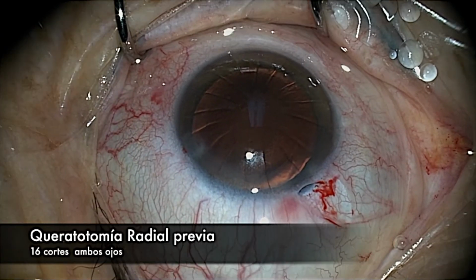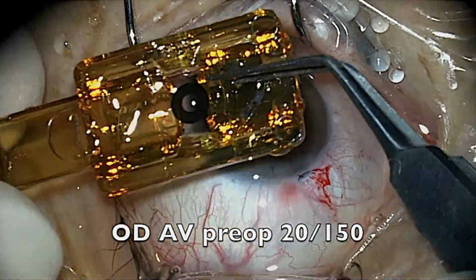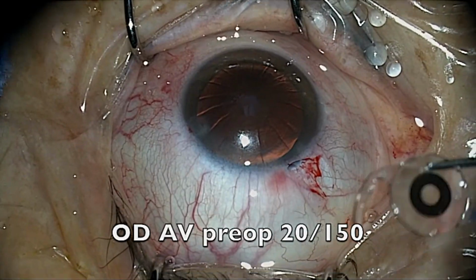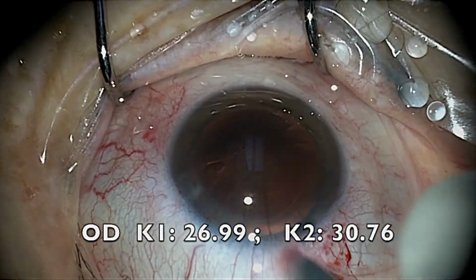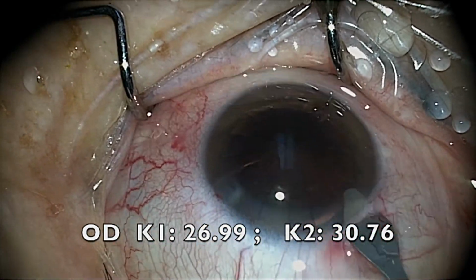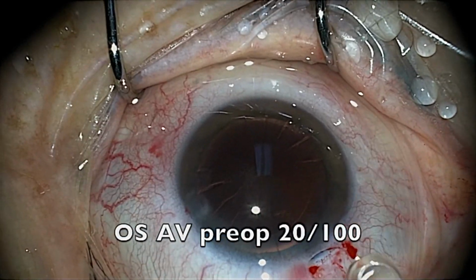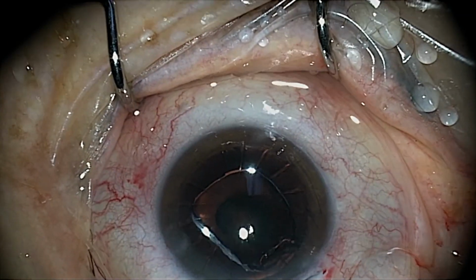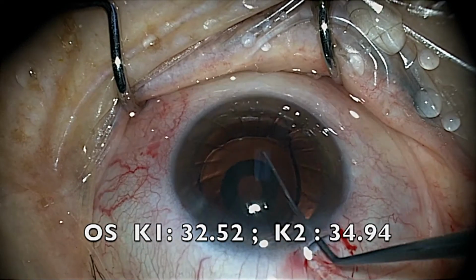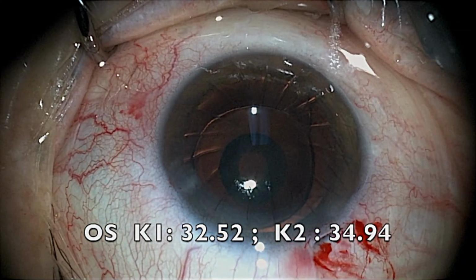This is the case that I just mentioned. You can see that the small aperture IOL goes easily through a 3.2 incision. Once we corroborate that the incision is clear, we insert the IOL in the bag, and it goes in as easily as any other IOL. You can see 16 cuts on that cornea. That makes it very irregular.